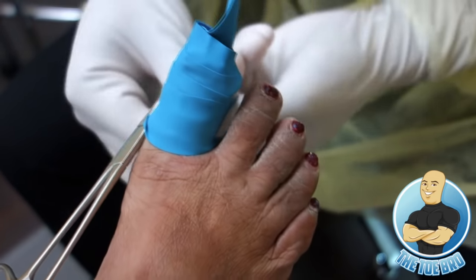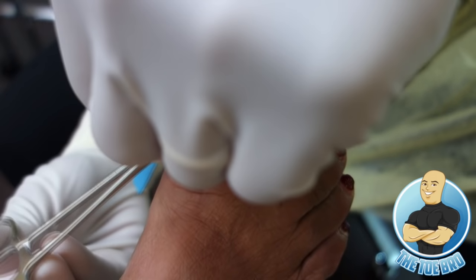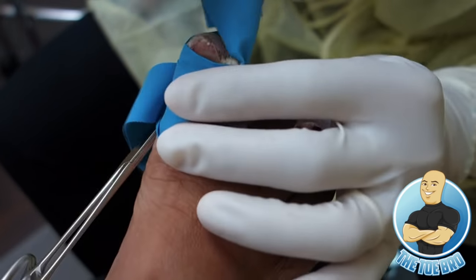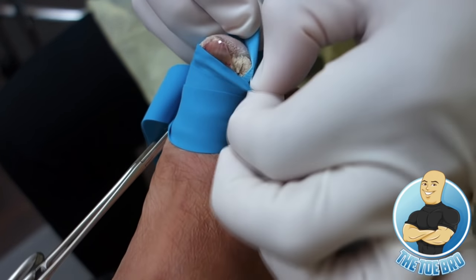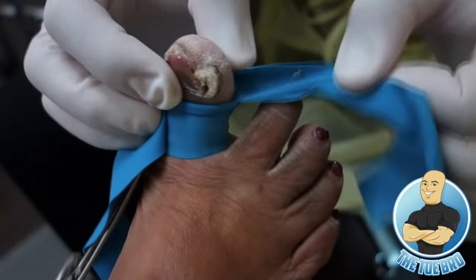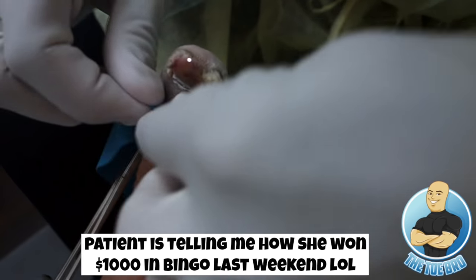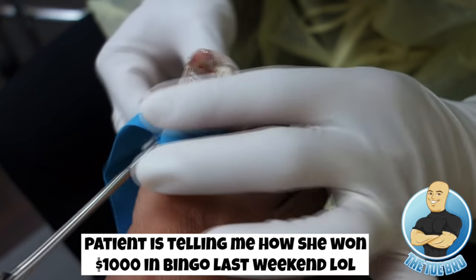The second reason is we're going to be using a chemical called phenol to kill the nail matrix. If there's too much blood, it will dilute the acid and the acid will not work. And it's possible that we have a nail regrowth. So it's very important whenever a nail surgery is done for an ingrown toenail or the removal of a nail, there's very little to no blood. So the chemical can work effectively and we have the result that we want.